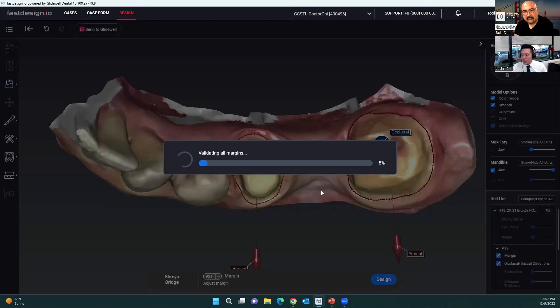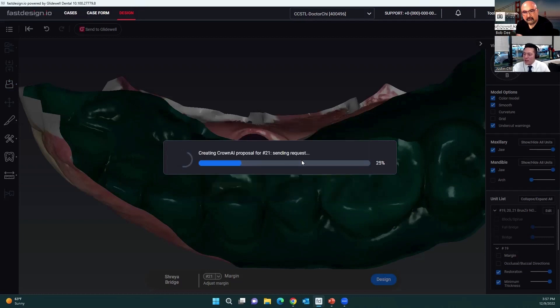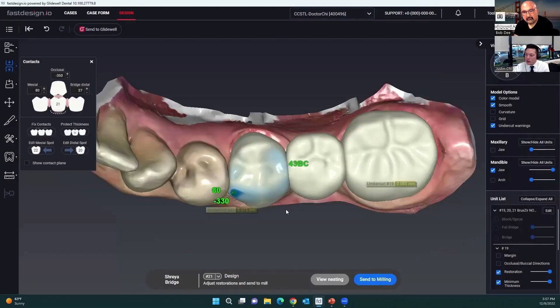We're going to hit design and the software is going to do its thing and create our design proposal. If there's a violation of any material thickness, it'll let you know. Usually if there is a thin spot, the software prioritizes creating enough material thickness for each restoration, so that shouldn't be an issue. And if there is, you can always add to the surface as needed.